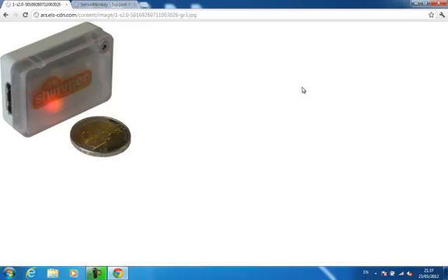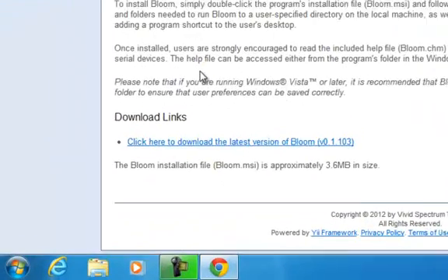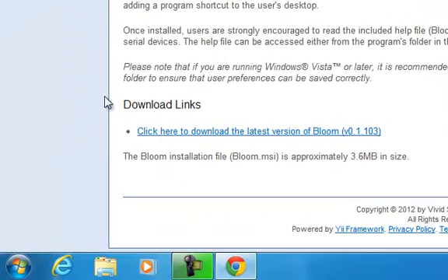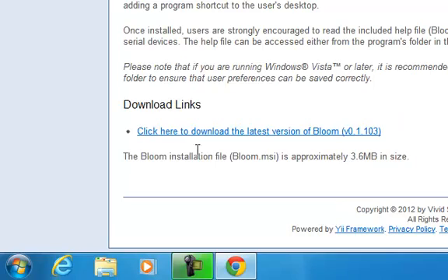I use Bloom to perform the mapping. You can download the Bloom installation file from the SensorMonkey support page. Once downloaded, double-click the file to install it. Once installed, you can run the program from the Windows Start menu.